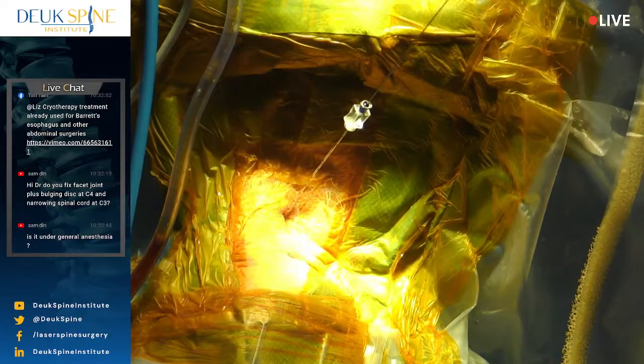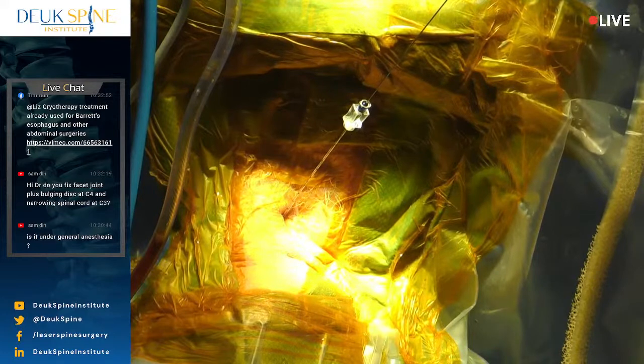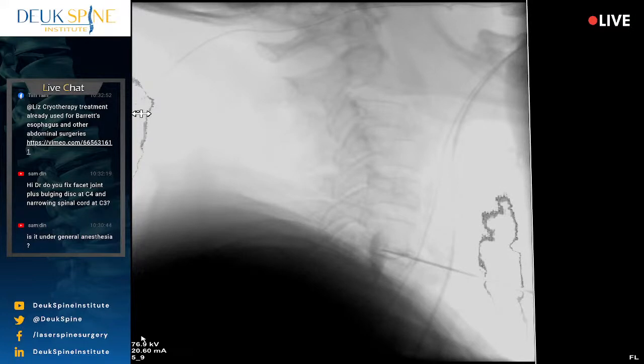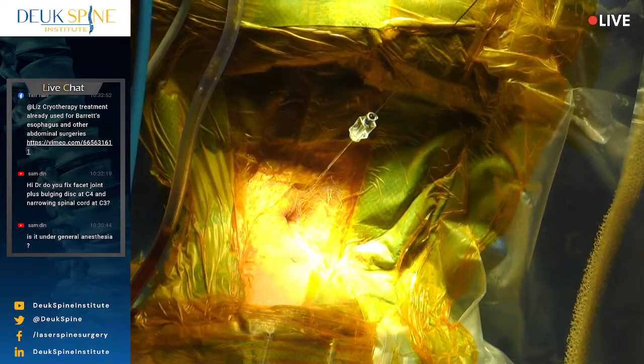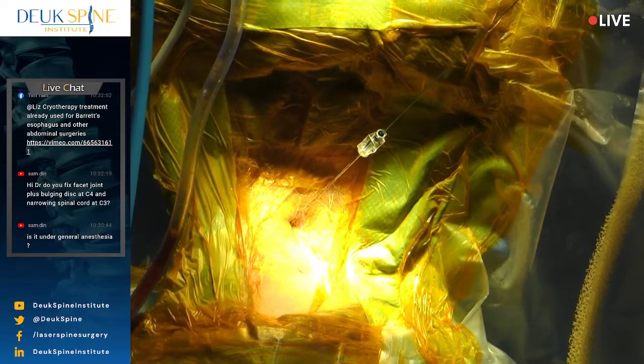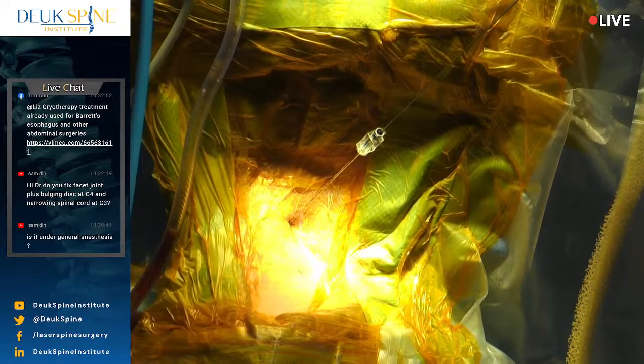Shot? All right, let's see if we can get a little bit better. I would say a little zoom in, a little bit of orbit because he's scoliotic. I would say you need to drop your side if I had to guess. And then let's get a little shoulder pull, just a little bit, and a little inline traction, just a little bit. And we should get a nice picture as long as we're not overexposed. Overexposed x-rays mean everything is so white. Not that we have a problem with white. It's just too much white is not good for x-rays.